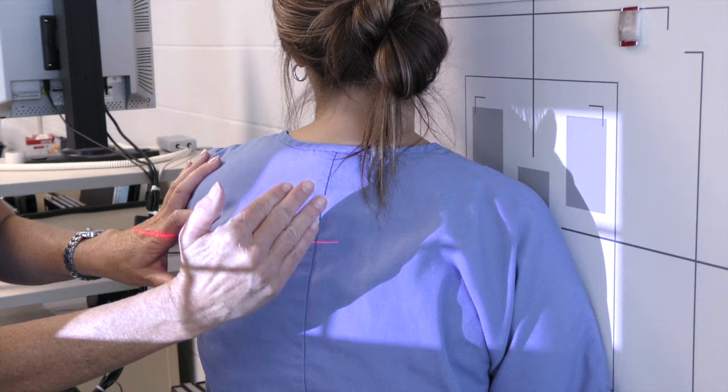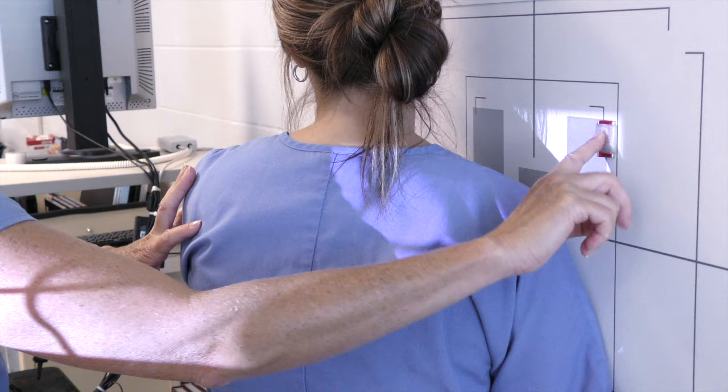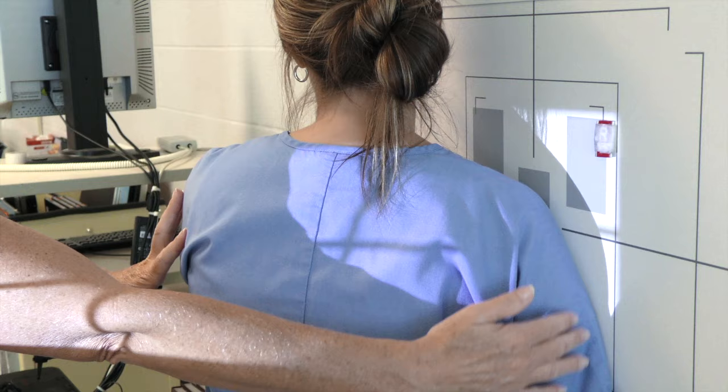Your centering needs to be two inches below the shoulder, shooting through your scapulohumeral joint — that creates the arms of the Y. Put your marker in the light and collimate. Your right arm hangs down and your left arm hugs the board, so your coracoid and your acromion create the arms of the Y.